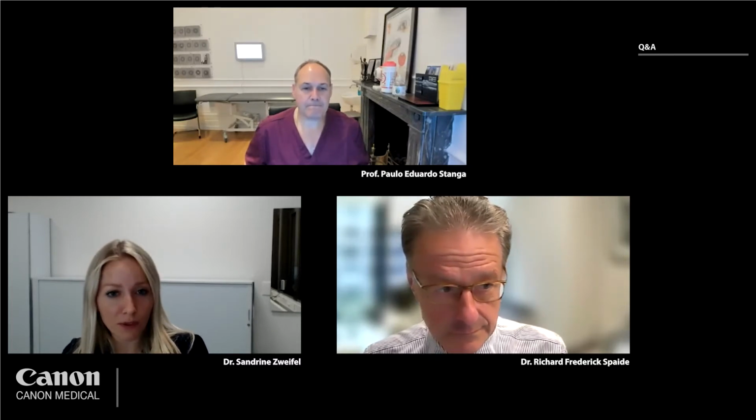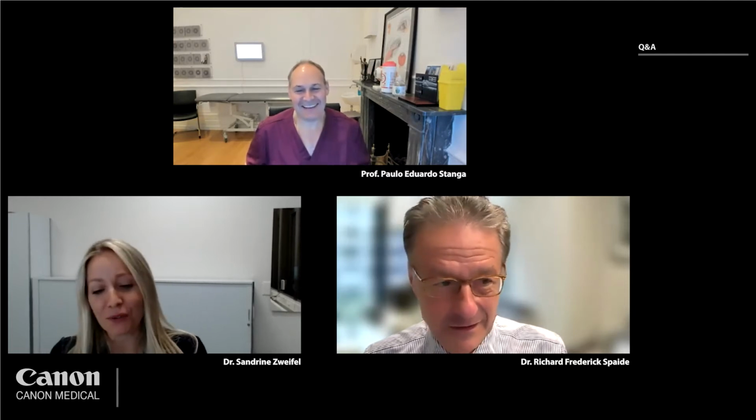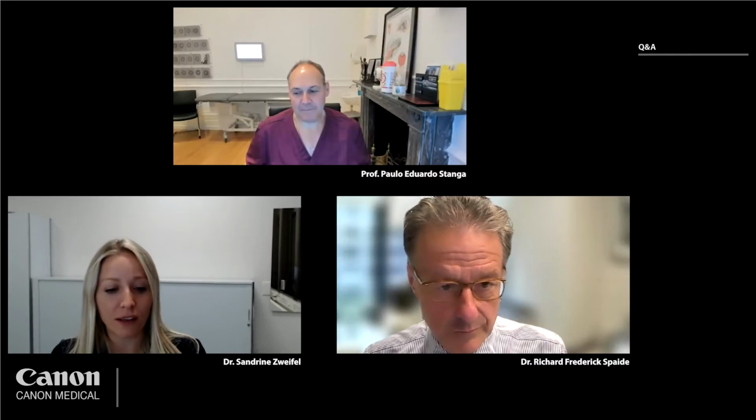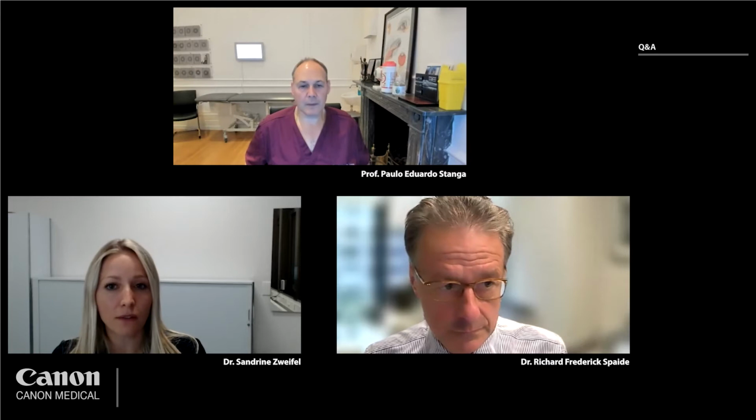So now I thought I can say something for Christmas for the Canon people, that we actually get back the device for a longer time. But you want to do what needs to be improved. I think, as Rick Spaide said, the advancements in technology are very, very fast.